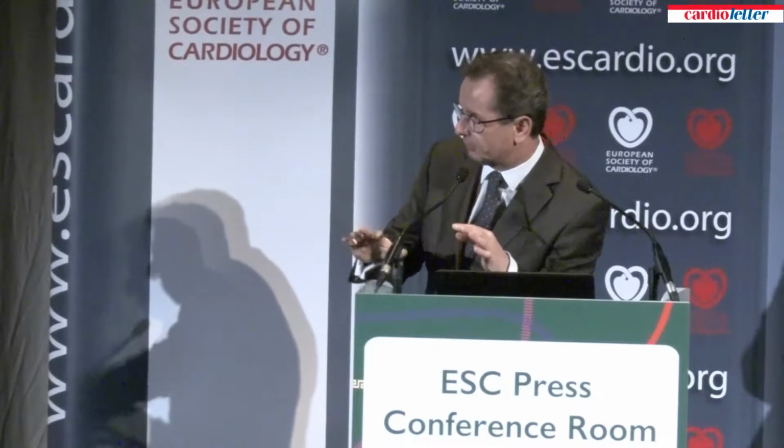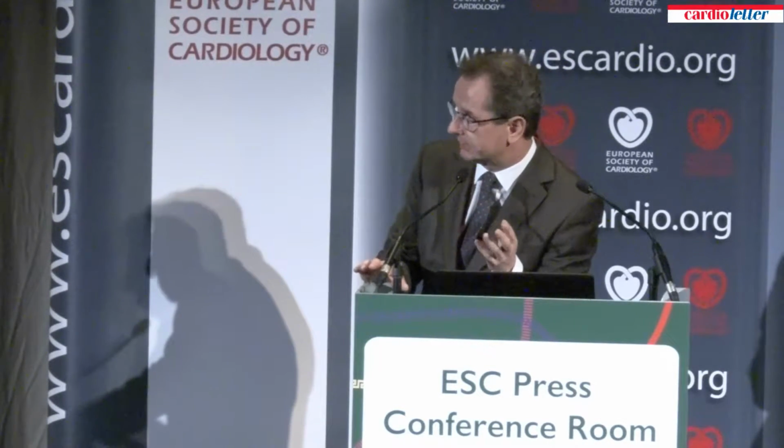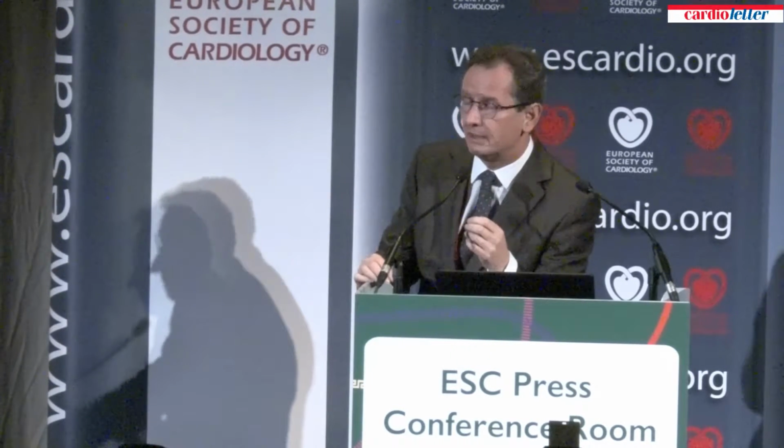At the moment, we mostly use TAP stenting, a kind of T-stenting. And many doctors I know from many conversations are very skeptical about Culotte. This study even shows that Culotte is safe and even better according to restenosis and according to the clinical follow-up. There was a consistent reduction of target lesion revascularization. So doctors who are working in daily routine in the cath lab should now consider this approach if they have patients with suitable anatomy for both techniques. This is what I'm now changing in my daily clinical practice.